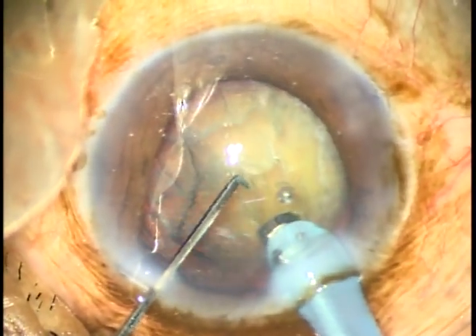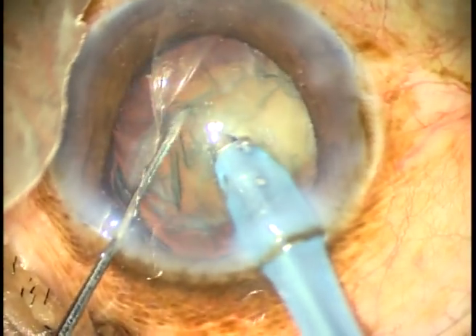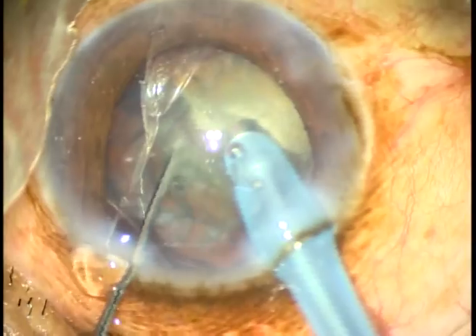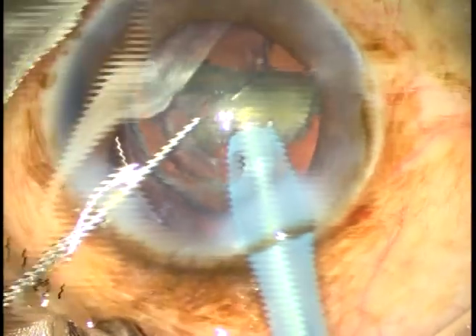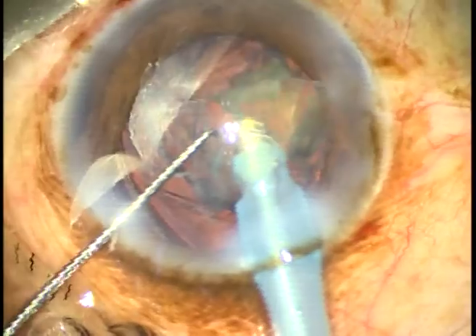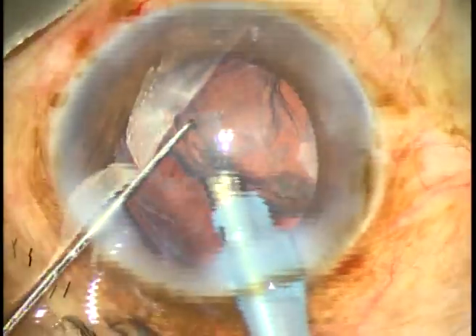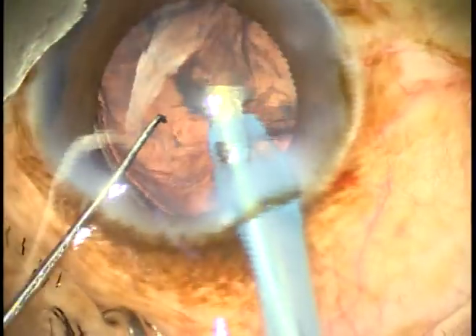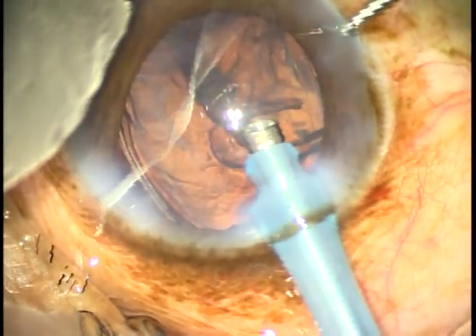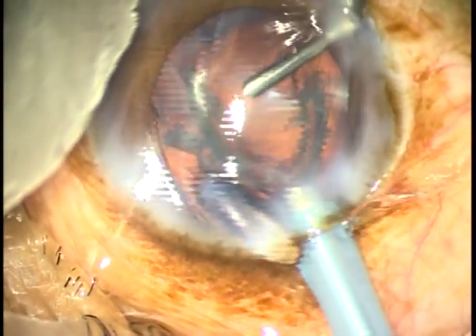Now the bag is supported and I do phacoemulsification by direct chop. I used the technique which I learned from Dr. Naran Badaloui — a no-hydro phaco technique. There is some epinucleus, and as I try to remove it, I find that the posterior capsule is coming. So I just flush out the epinucleus, inject some viscoelastic substance, and come out.